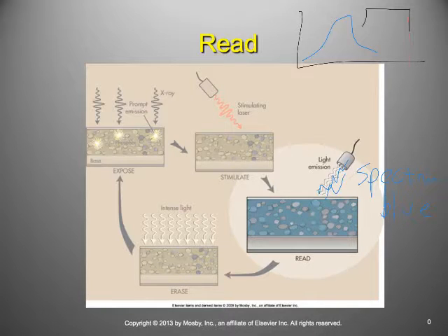So just like in CT scanning, where there's that ADC, the analog to digital converter, this has an analog to digital converter too. It's going to take that analog signal that it sampled and it's going to quantize it. Quantization sounds like a made-up word. It's a real thing. What it means is it's going to assign it a pixel value. So quantization means it takes that analog signal and assigns it a pixel value. Quantization is what the analog to digital converter does. The ADC takes that analog signal, quantizes it, or assigns it a specific pixel value.